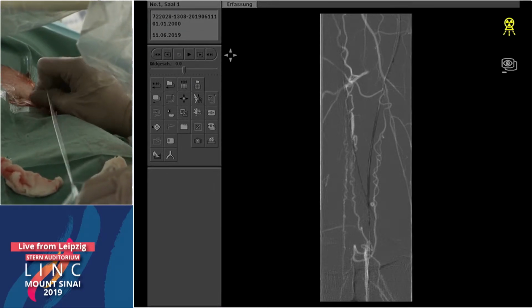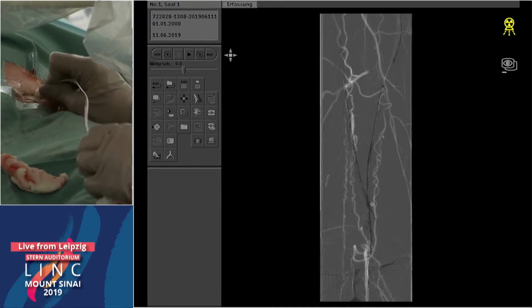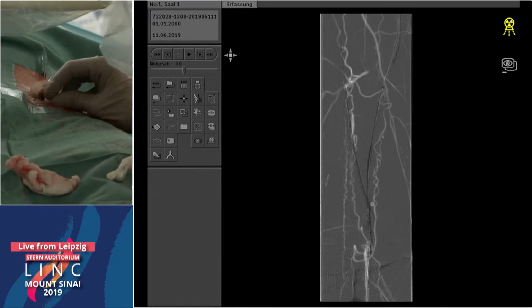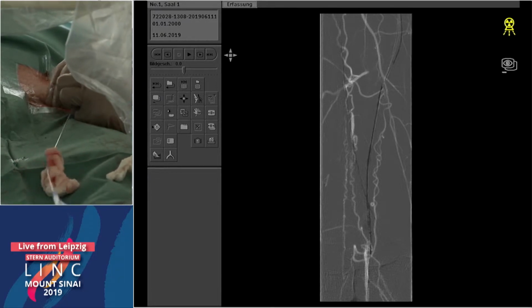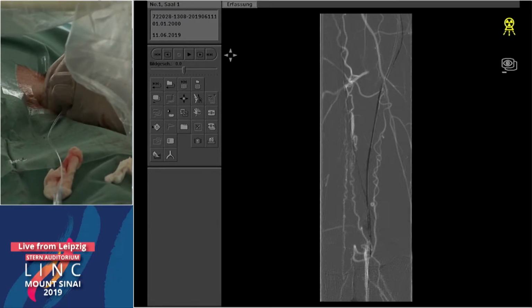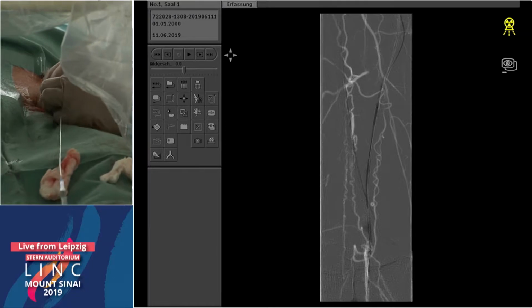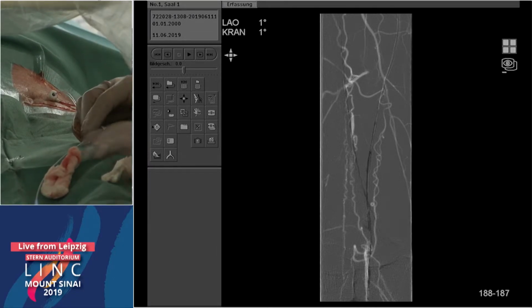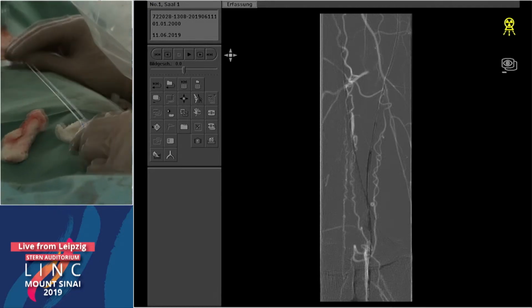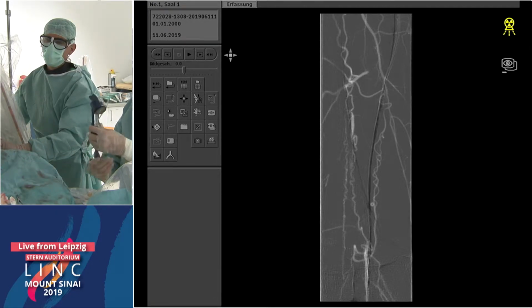That's a good question. I think I'm just partially subintimal. Again, here we have problems. And will the scoring balloon still be effective to somehow crack the plug, give me a bit, make it easier to open that plug? I think yes, but if you are subintimal, but you are scoring.